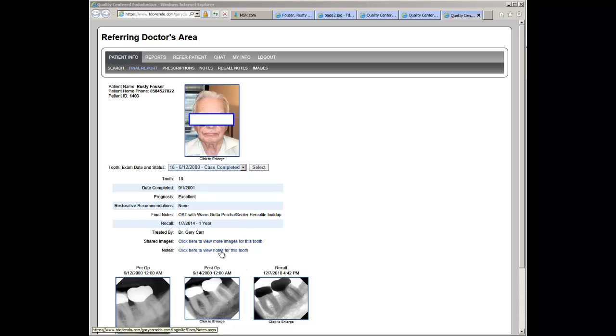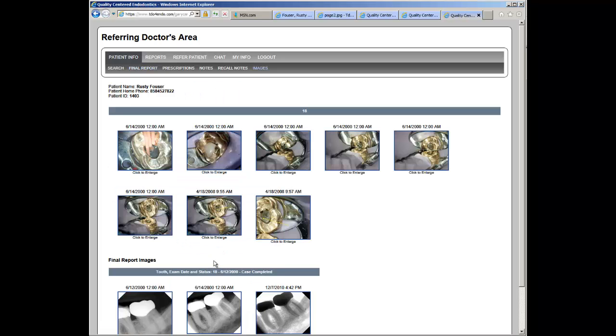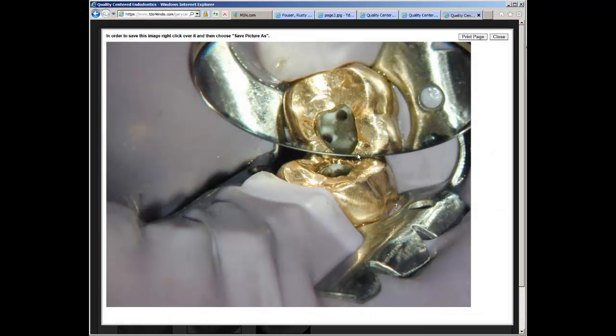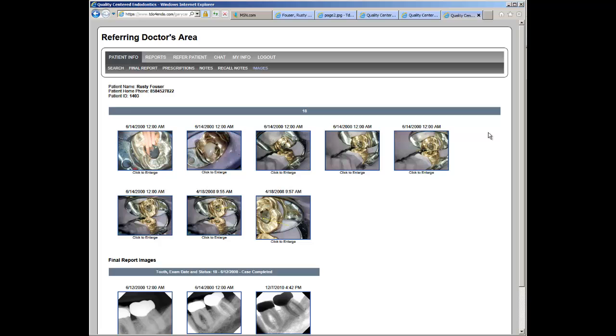You also have the ability to view all shared images that were marked for this case. Now you pick which images you wish to have shared with your referral sources. An image can be clicked and it can be made larger. And these can also be saved by the referral sources as well to their computers or printed directly from here.